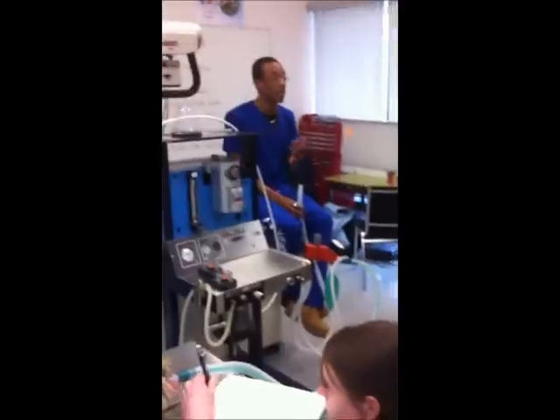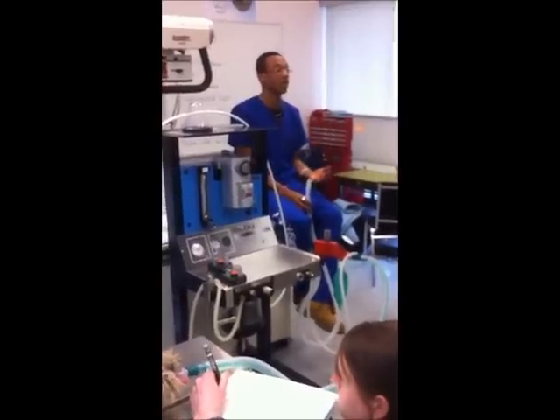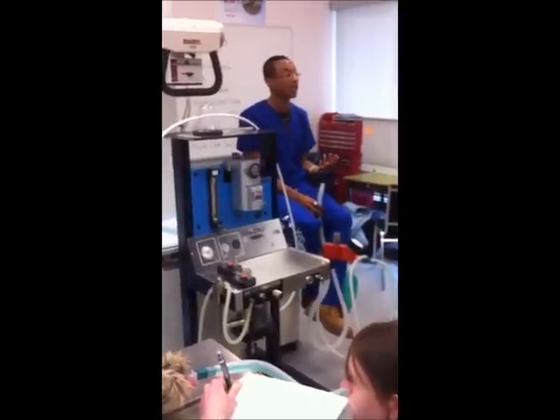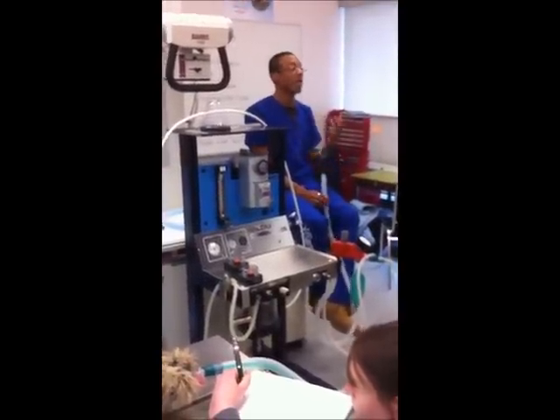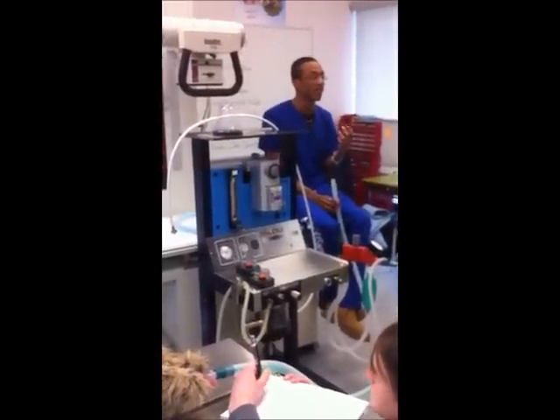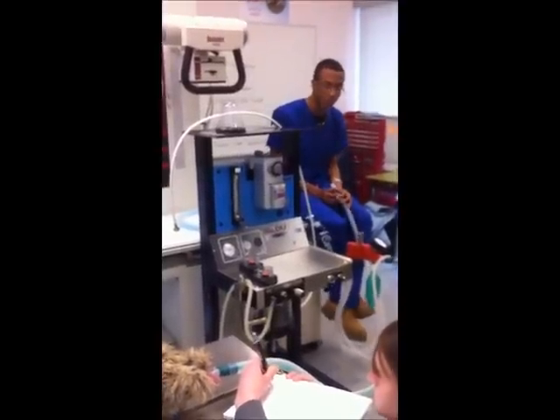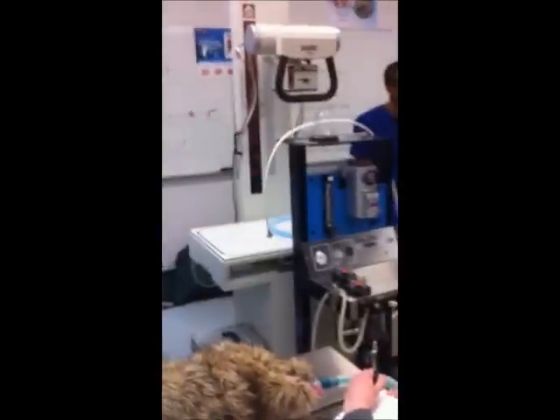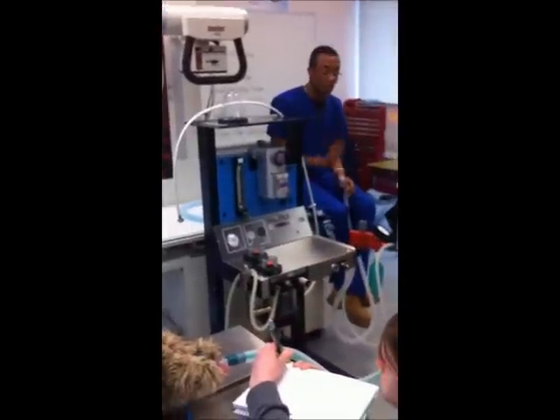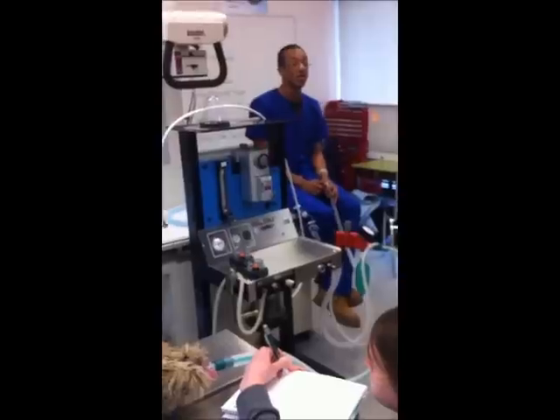Think of it this way. The patient is starting to lose his body function. What is one thing we are doing to this animal that's probably causing that? Cut off the anesthetic. Turn off the anesthetic. More oxygen? Well, not necessarily. You might want to bump up. Yeah, that's the idea of bagging, is actually getting more oxygen into the lungs. But the animal's not breathing at this point in time. So you're making him breathe. It's like CPR. Squeeze the bag. Not just yet, because we're now turning off the anesthetic gas. So no more poison to your animal.